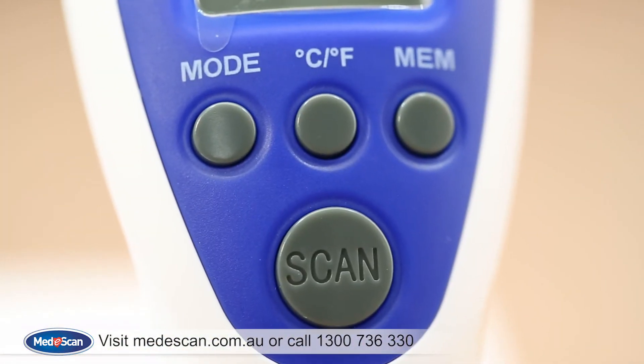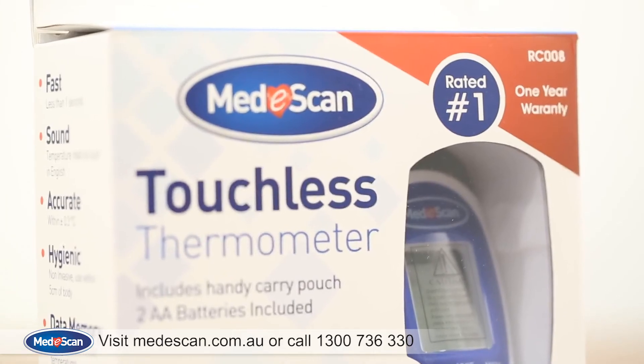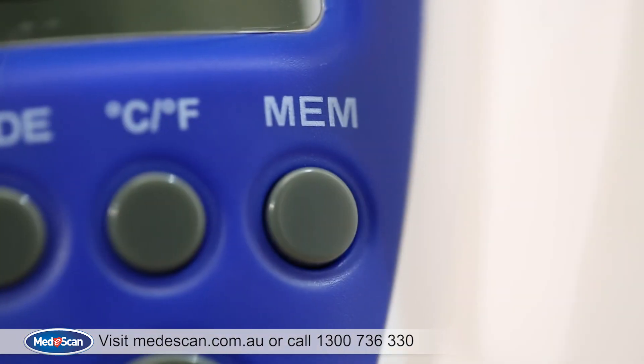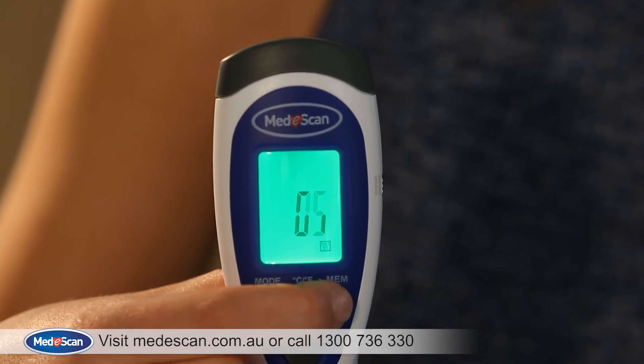The MediScan Touchless Thermometer also gives you the ability to switch between Celsius and Fahrenheit by simply pressing this button. Another unique feature is its ability to hold up to 32 reported temperatures — just push the memory button to access your last 32 temperature readings.